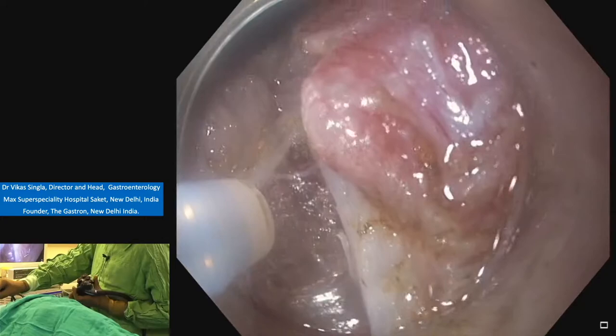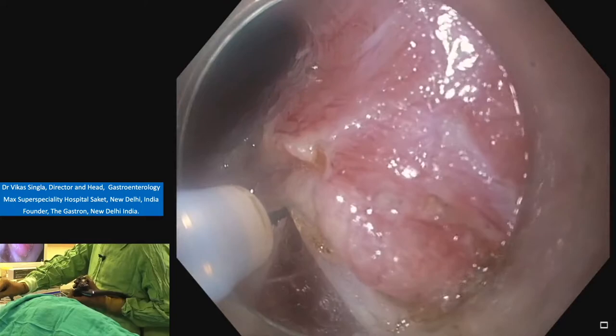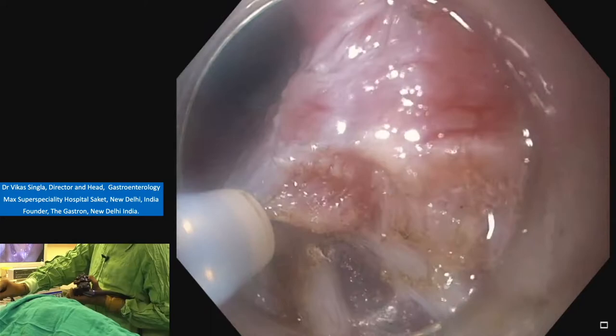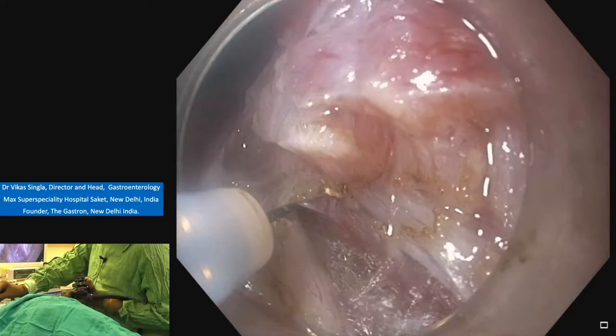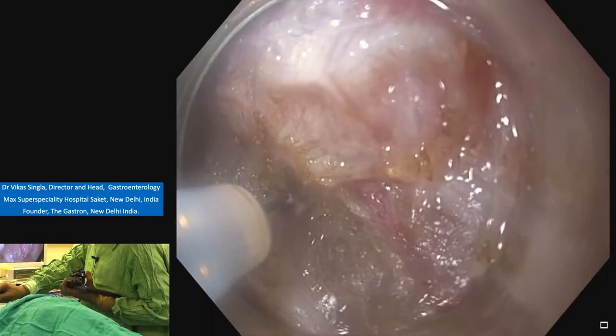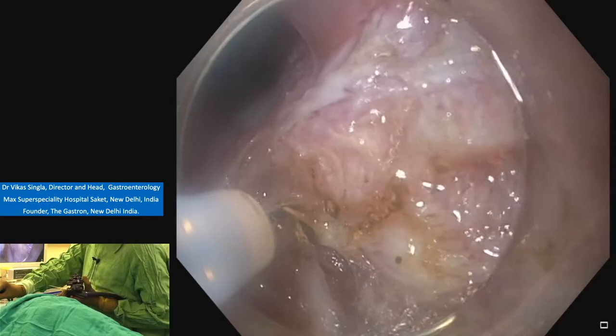Again, lift, and then cut. Knife out, below the muscle layer, cut. Below the layer, so one has to be very careful, avoiding the injury to the deep adventitia and the mucosal layer. Coagulation, then cut.